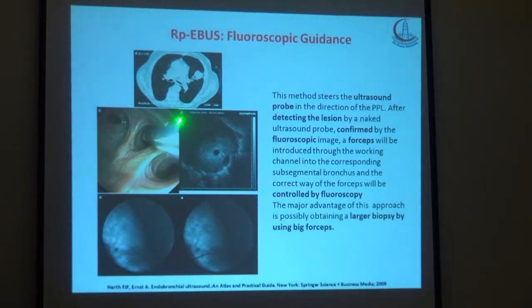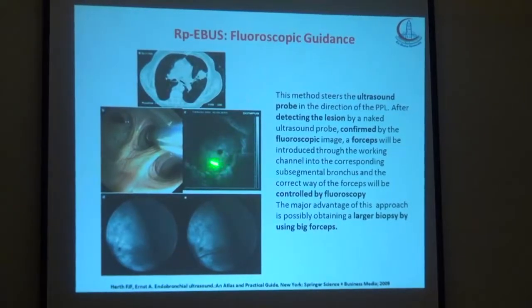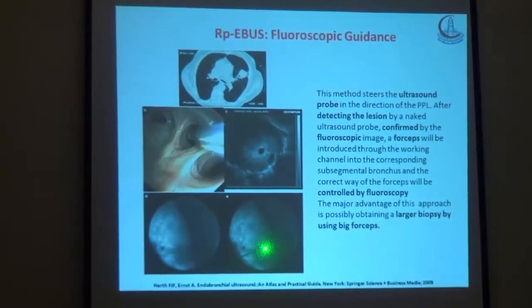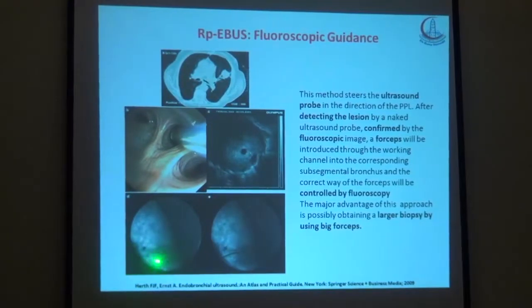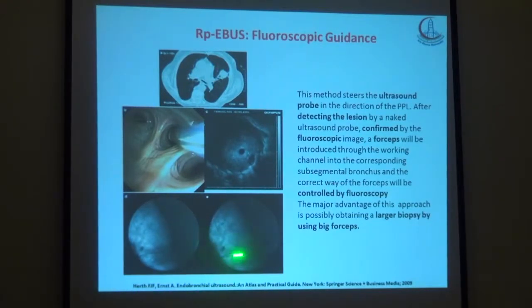بتدخل الألترا ساوند بروب لحد التيومر، بتفضل تحرك الإبرة يمين وشمال لغاية ما التيومر تبتدي تبان لك. أهو، أدي الرينج بتاع الحتة السودا. طبعا في ناس بتشتغلها من غير الفلوروسكوبي، وممكن تشتغلها بالفلوروسكوبي. بالفلوروسكوبي هتساعدك إنك بعد ما تعمل كونفرميشن للي شفته بالسونار، تاخد البيوبسي.